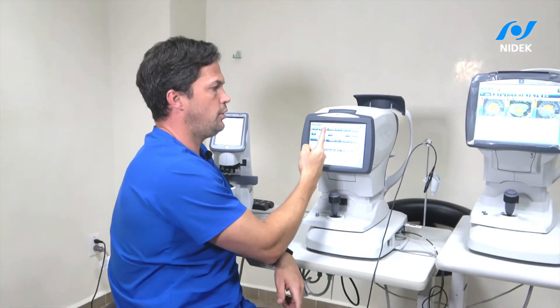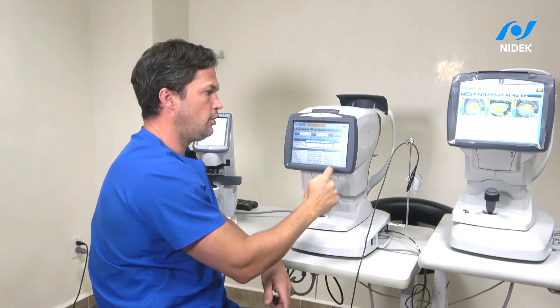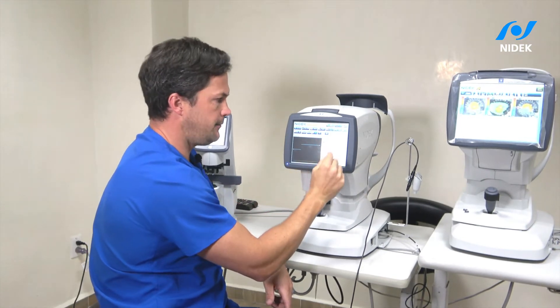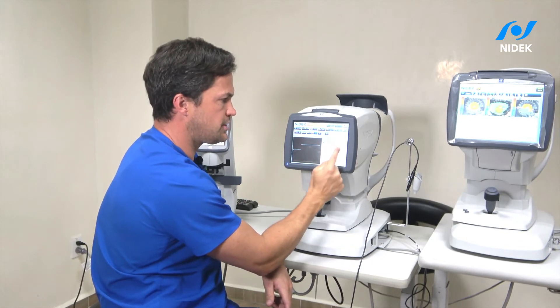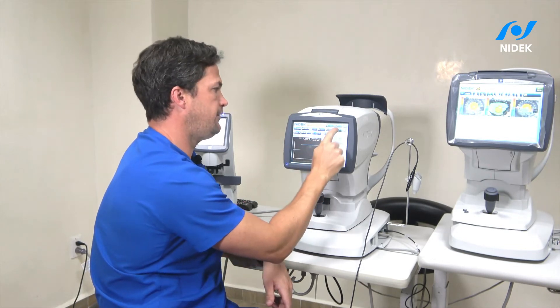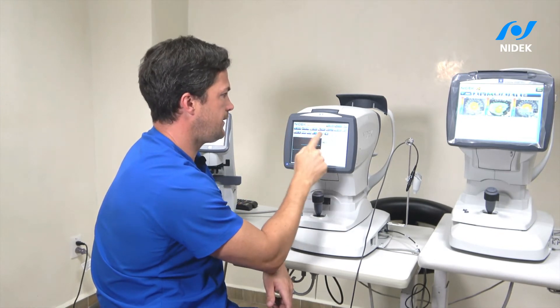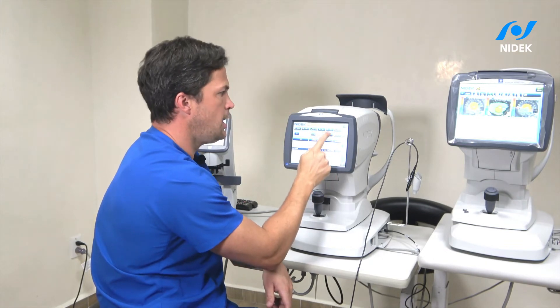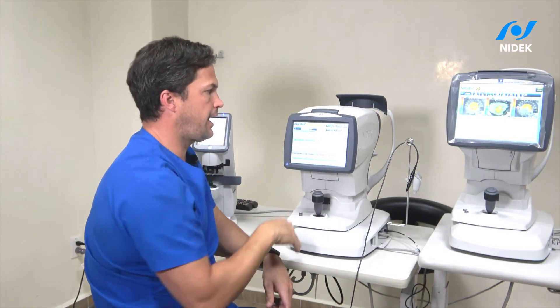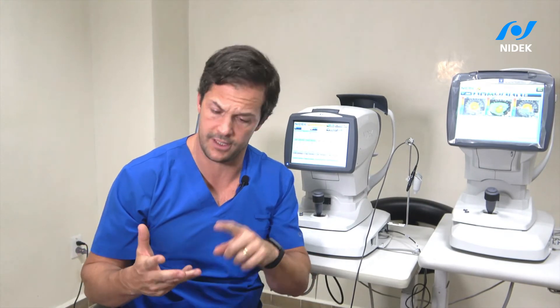So to recap: you have the optical biometer, you can calculate the toric very specifically and correctly, and you can also use contact ultrasound. You can verify measurements live for right eye and left eye, and then go back to the patient to do the IOL calculation. With this machine I'm very confident — I have a trained assistant who can do the measurements, and I can solve almost 100% of my patients.